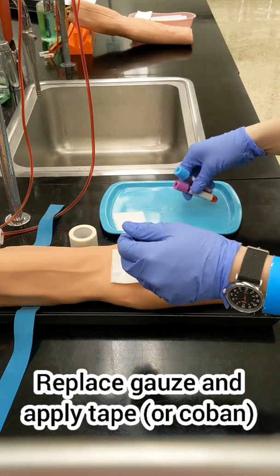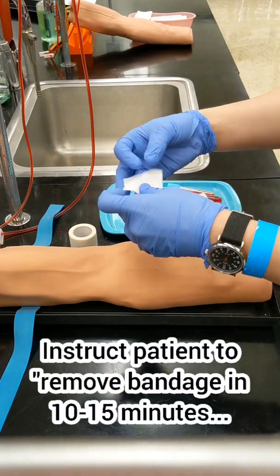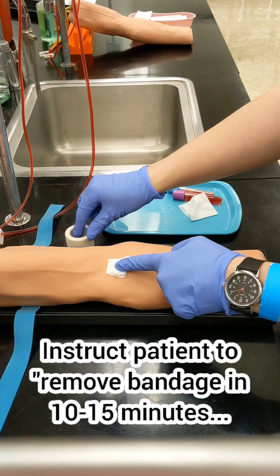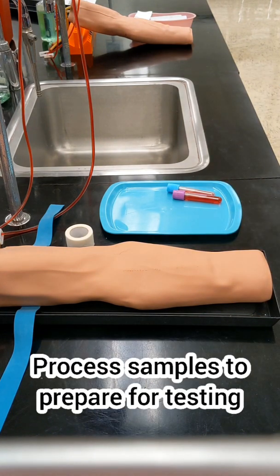Set your samples aside and finish caring for your patient. Take that little piece of gauze and fold it up to replace the gauze you were just using. Apply tape or co-band and instruct your patient that they can remove the bandage in about 10 to 15 minutes. If the site is still bleeding after they remove the bandage, they'll want to apply pressure, and if it's still bleeding after that, they should call the clinic.